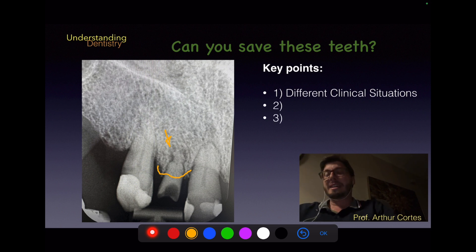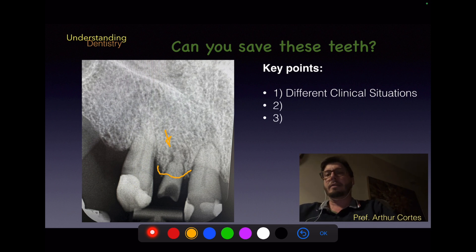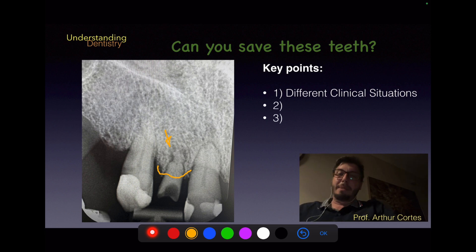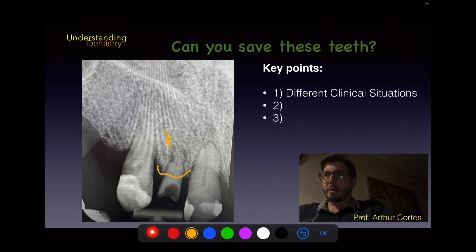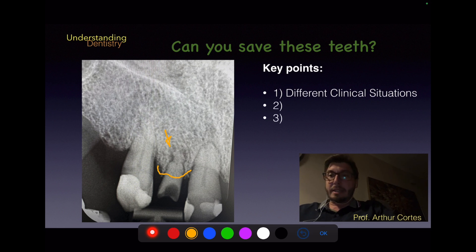Even if a good endodontic treatment were achieved and a post placed, the root dimensions and bone level make the predictability of this tooth very poor. This tooth should be extracted — that is the most predictable treatment. My decisions reflect different accepted approaches, as long as we follow an evidence-based approach using referenced articles and textbooks.